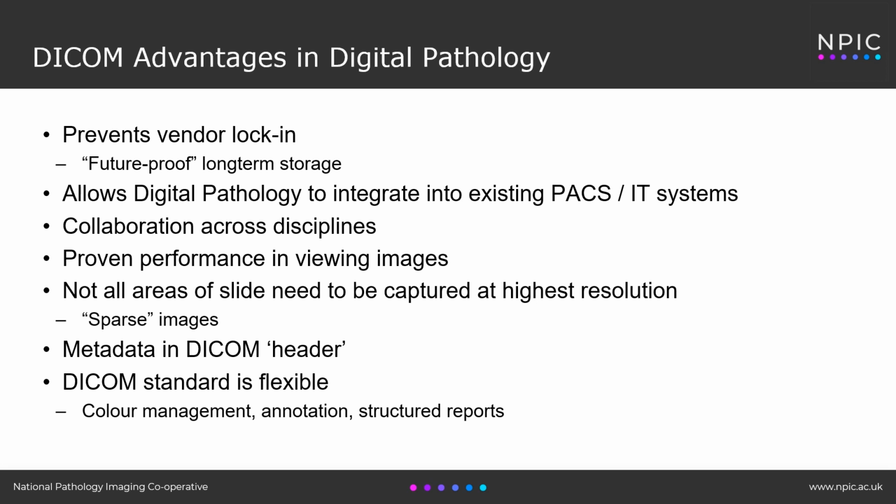if that's indeed possible. It also allows digital pathology to integrate into existing PACS or IT systems, which might be particularly important in procuring of digital pathology solutions, in that if it can be fitted into your existing radiology PACS system, that might be a big cost saving.